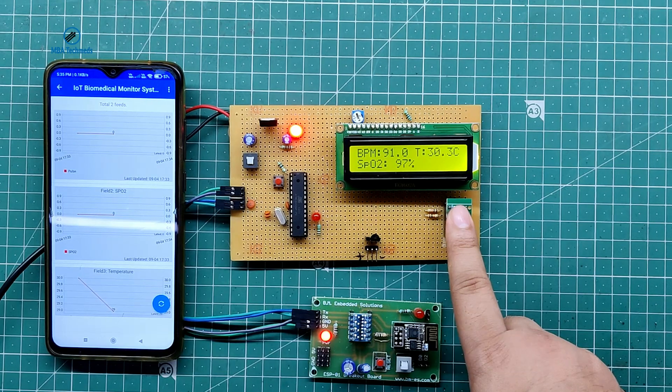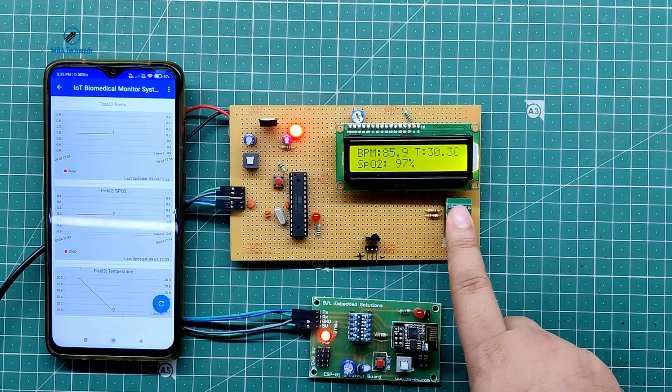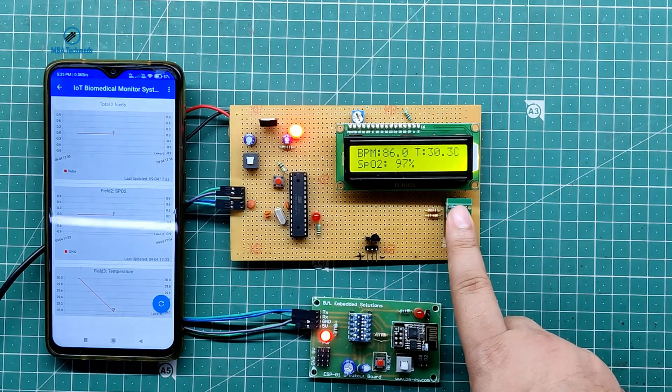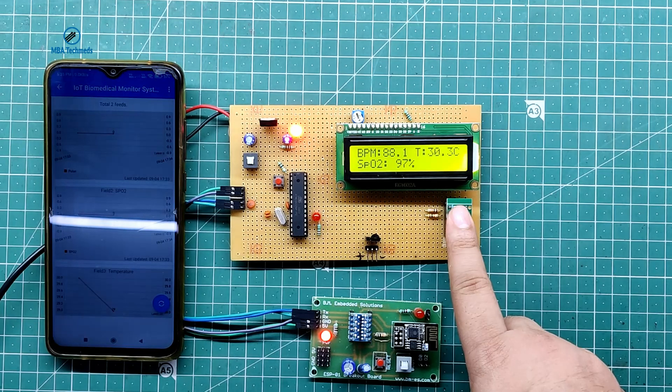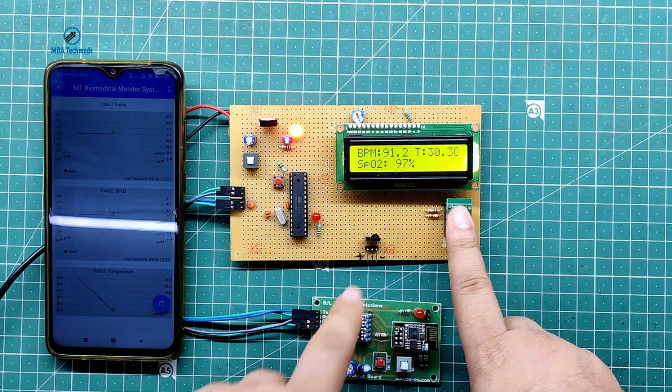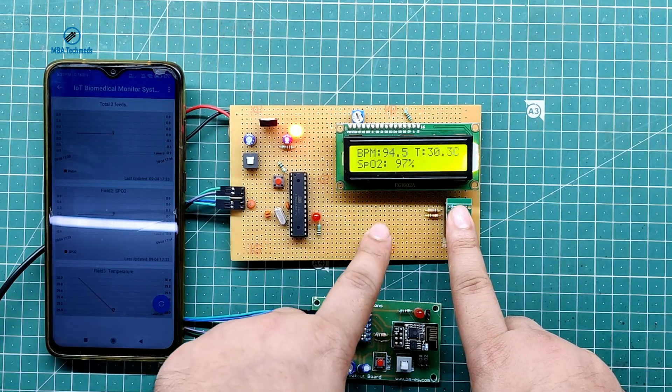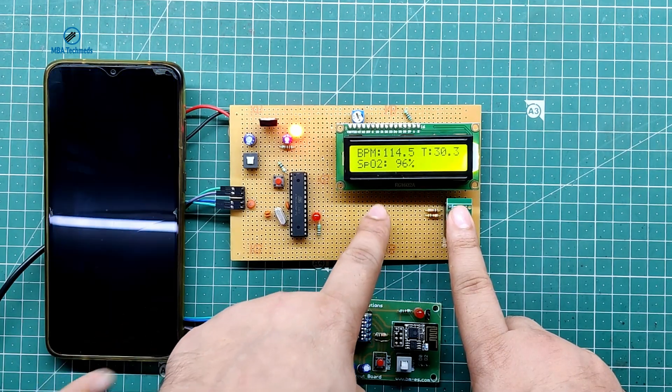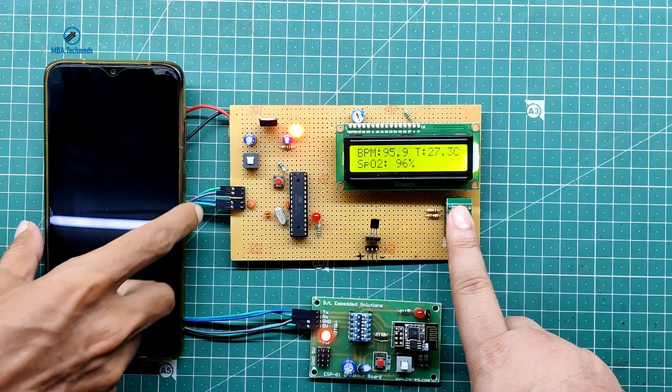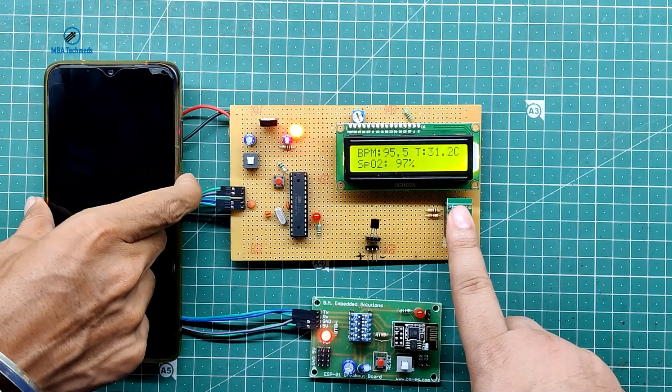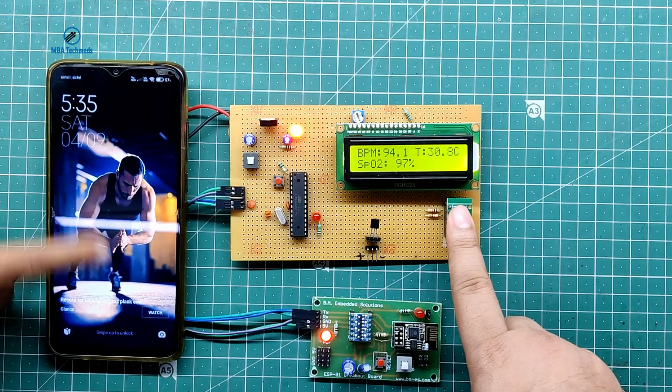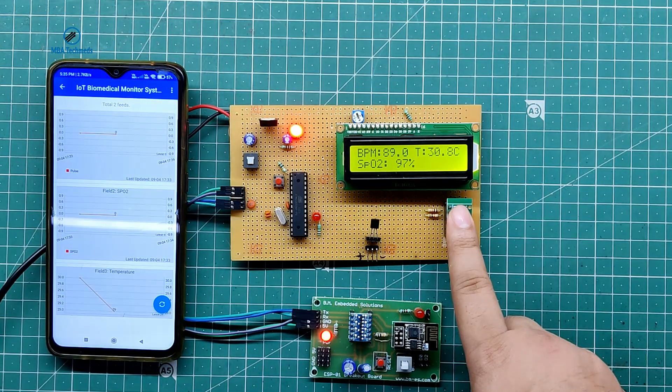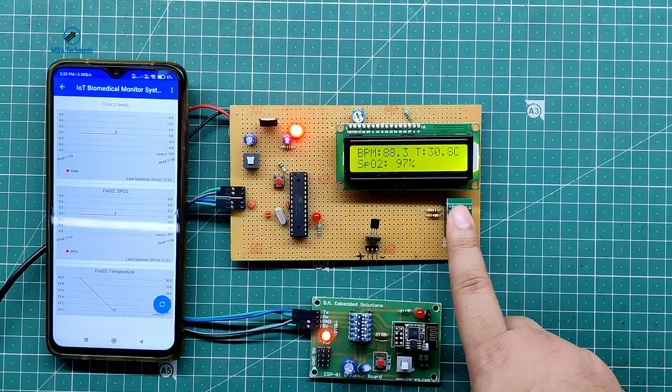Now you can see when I place my finger, the pulse rate is around 80 to 90. Temperature is stable because it is being monitored of the room, and SpO2 is 97.